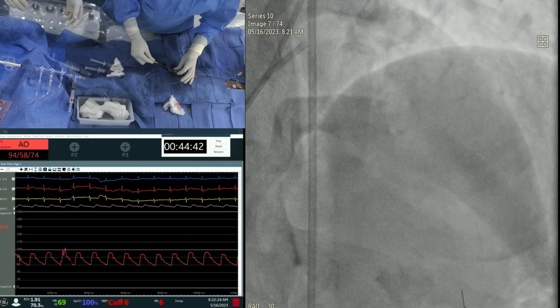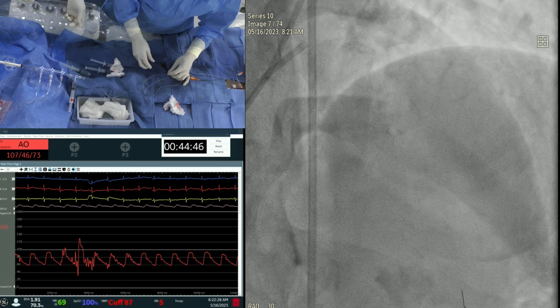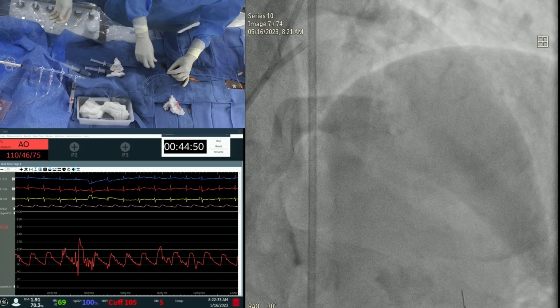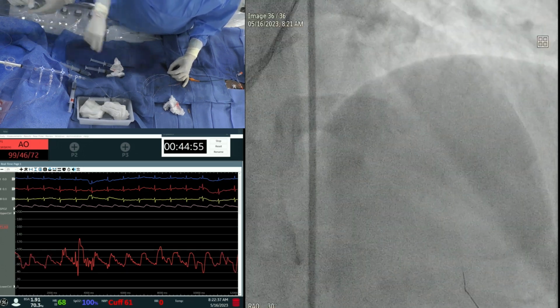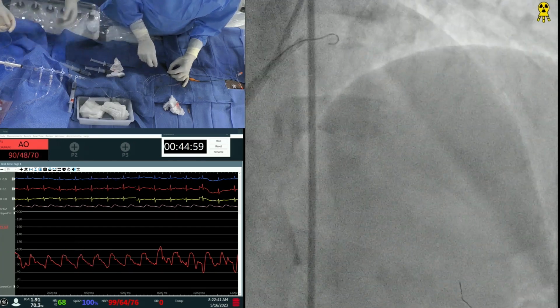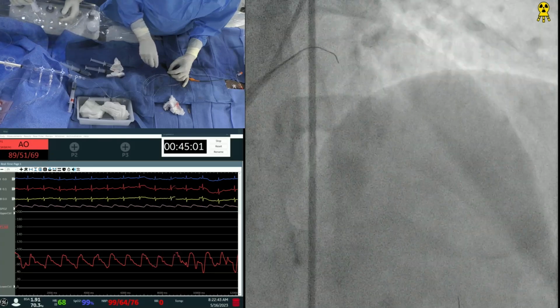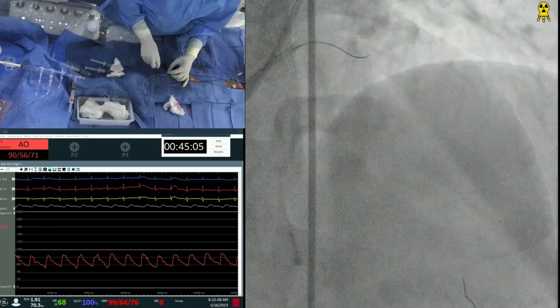Okay. So we're replacing our LAD, our rota wire, with the run through, which we used earlier, and get a Fielder wire. Yeah. The same Fielder that we used. Yep. How is the tip? Okay. Yeah, very good. Everything keeps going into the D1, occluded D1.